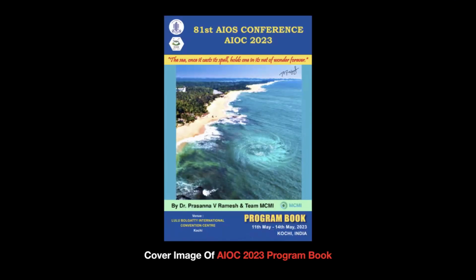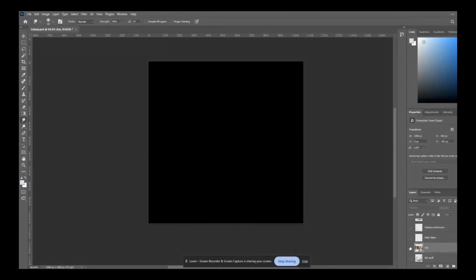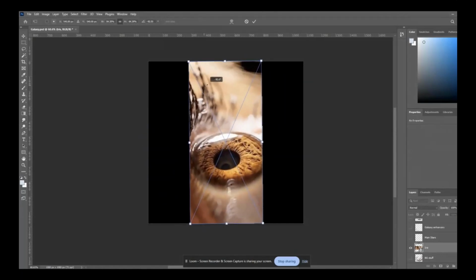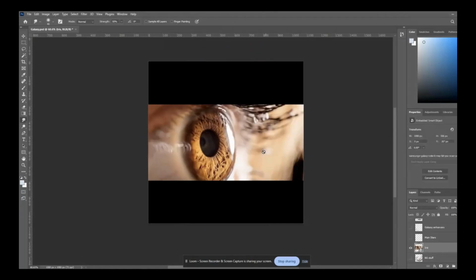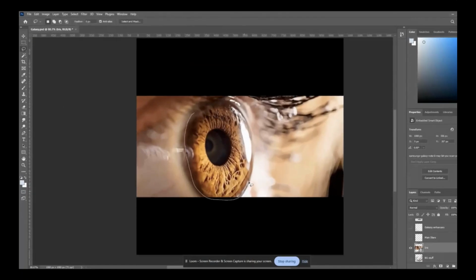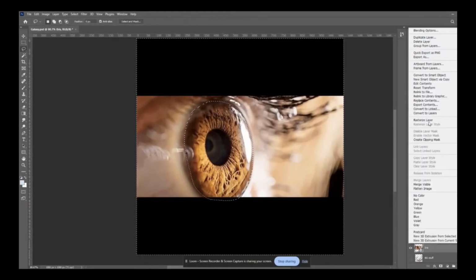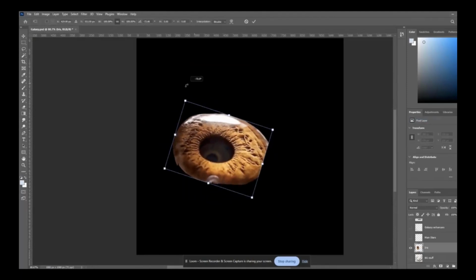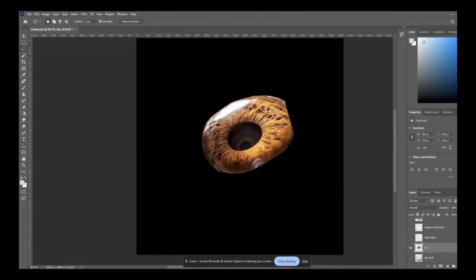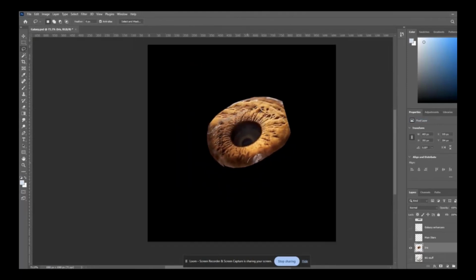So how did I do this image? This is again one of the very nice ones. You can always pitch yourself into these kinds of imaging modules for our AOS forums also. A simple patient's eye from the side angle view with illumination from the front was taken. The real eye, that was not AI, this is human intelligence, but the drawing was done digitally. The same real eye was horizontally put, and you can see that these edges were removed because they had some glare. See, I'm removing the glares here.